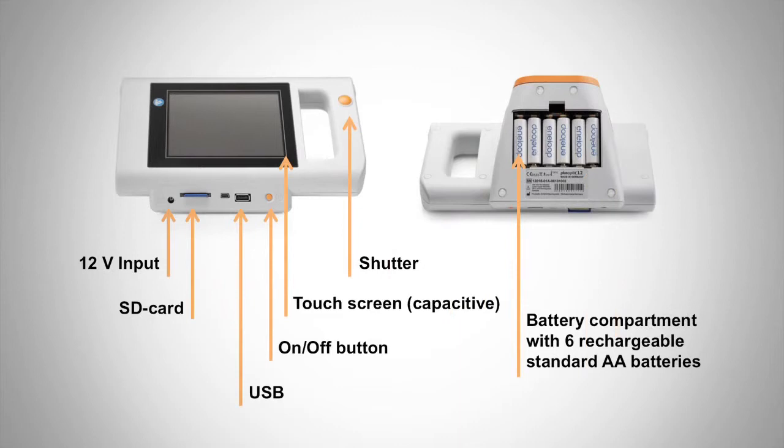You should also familiarize yourself with the Plus Optics S12 hardware: the 12-volt power input, SD card slot, USB card slot, on/off button, touchscreen, shutter, and on the back of the unit, the battery compartment with six rechargeable standard AA batteries.